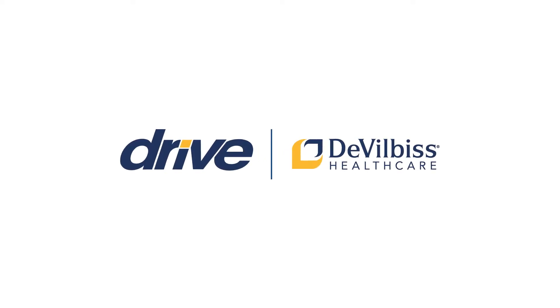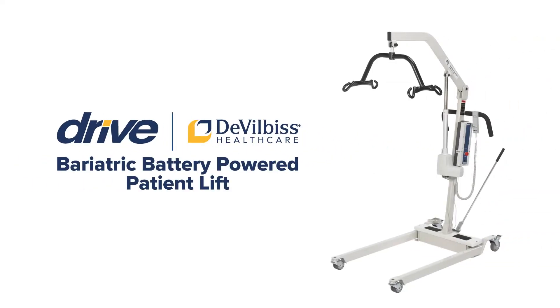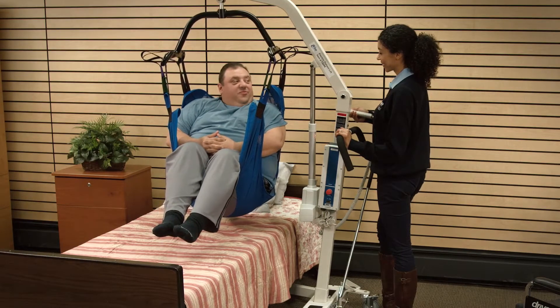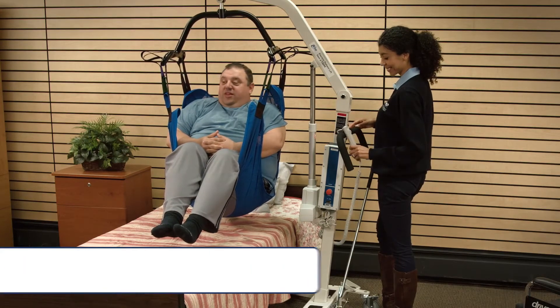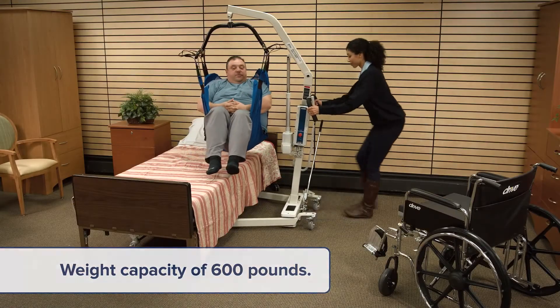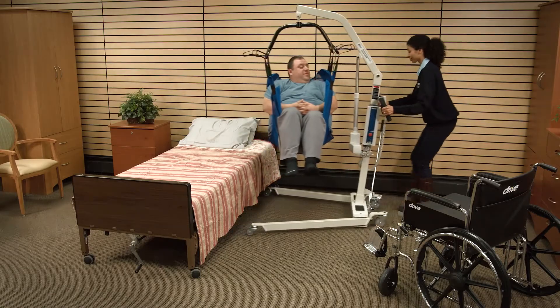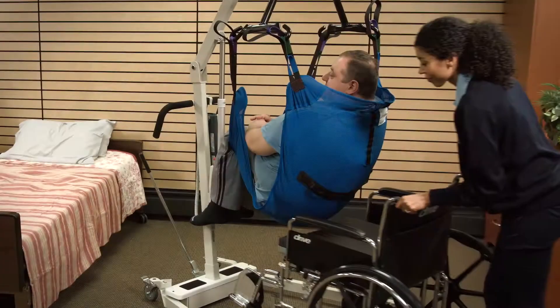Thanks for choosing the Drive DeVilbis Healthcare Bariatric Battery-Powered Patient Lift. This video will enable you to successfully operate the Bariatric Battery-Powered Patient Lift, which is designed with a weight capacity of 600 pounds. The lift allows a medical professional or attendant to comfortably and safely transfer a patient from one resting position to another.